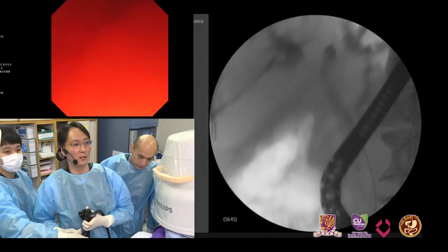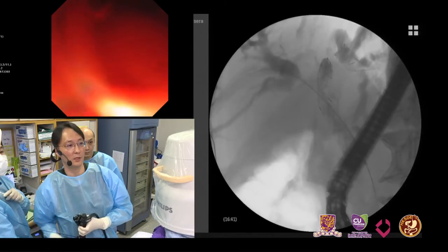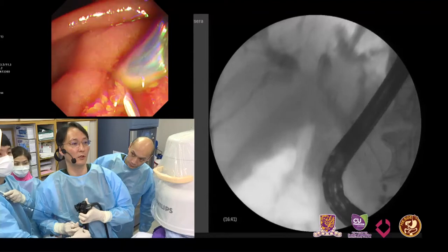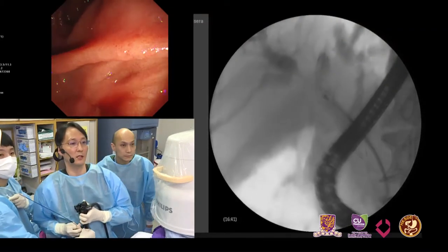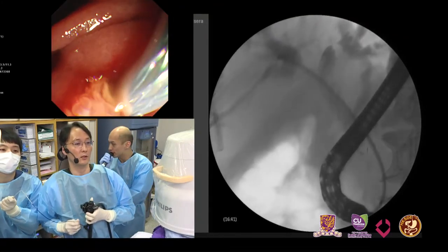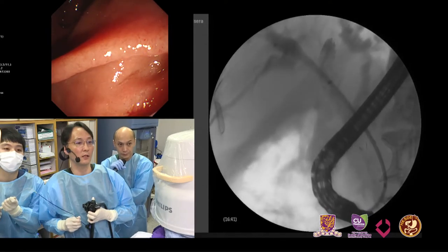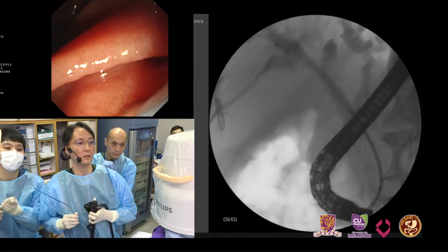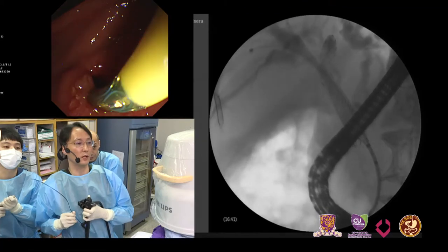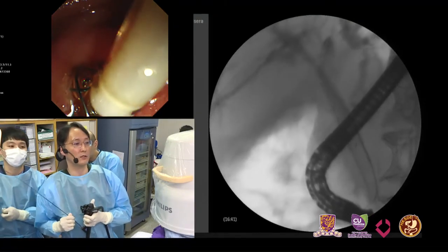Okay. Now I place a stent inside the stent. Stent-in-stent technique. Now the scope is changing the CO2. Okay, sure. So follow. Second one here. Wow. So you don't have to dilate the LCD stent. Release. Okay. Go. Looks like your stent is in a nice position. It's good. Okay. Deploy. Done. So any questions or comments?